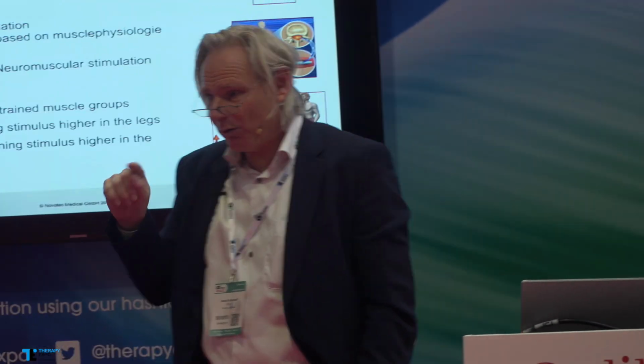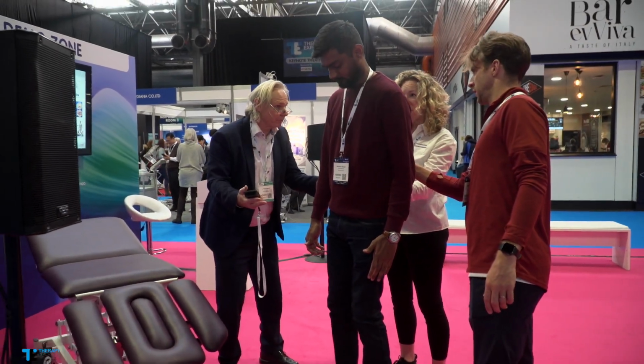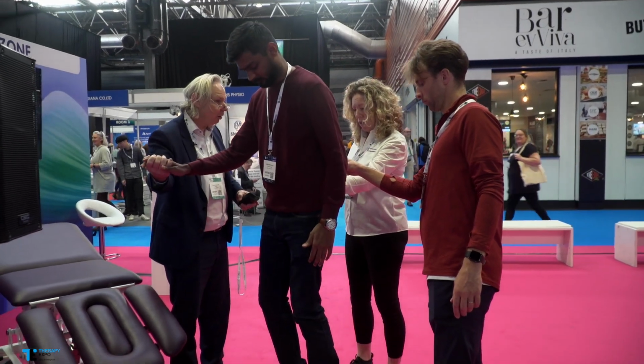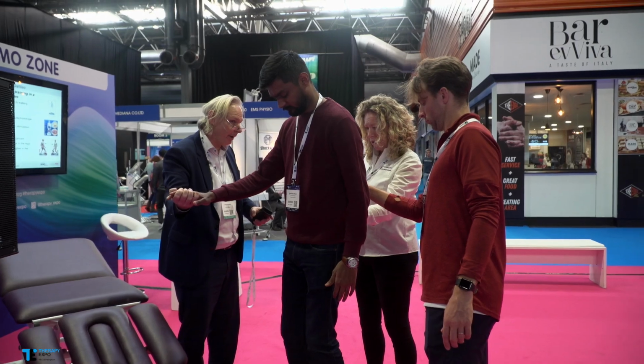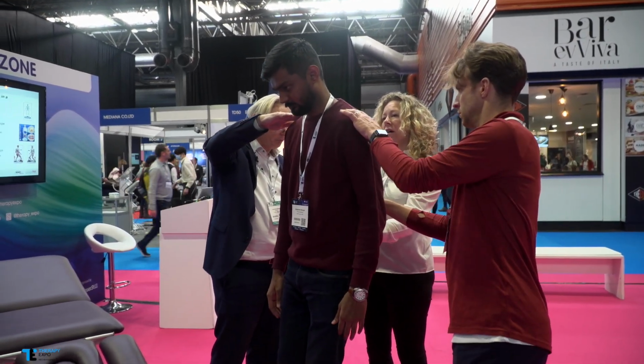So who wants to try the Galileo system once? Okay, come slowly upright, come upright slowly, then you feel more and more your back muscles. So give me your hand, go on your toes, and this is out of your back, it's less in your back. Yeah. Now go down again, it's in your back. But there's no vibration here on this level, very little.